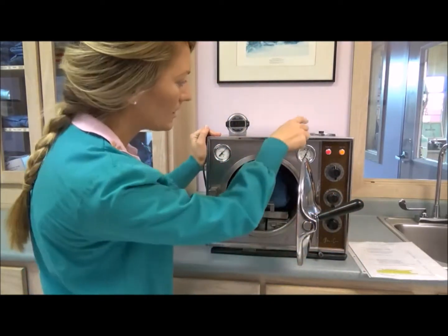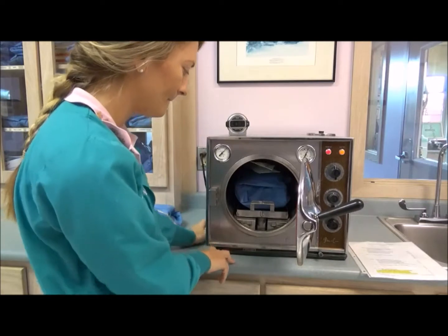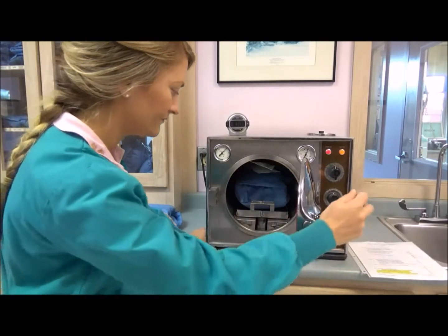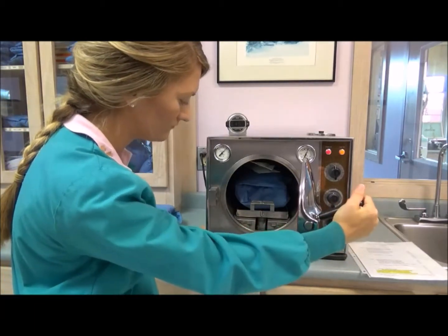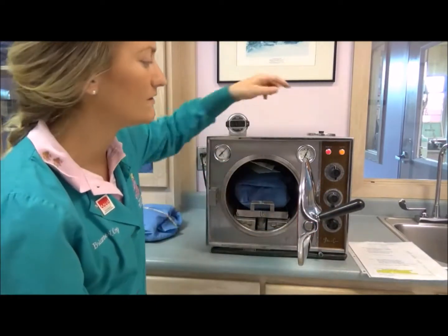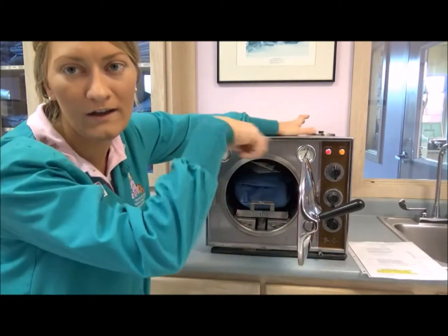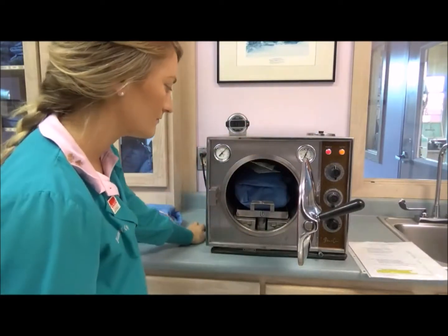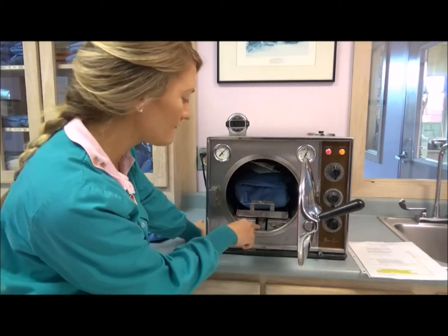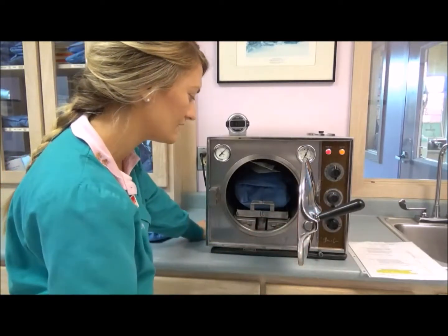And then the distilled water comes from the reservoir tank, and it's going to fill up the bottom portion of the autoclave here. That usually takes about a minute or so. Another thing you have to make sure is make sure it's filled with distilled water. Over here is where you would fill the water. I've already done that prior. There's a fill line in there that tells you where you want it always full to. And then in here there's a little plate, and as soon as the water touches that plate, that's when we close the door and tightly shut it.